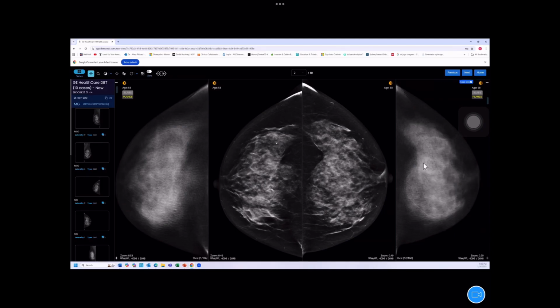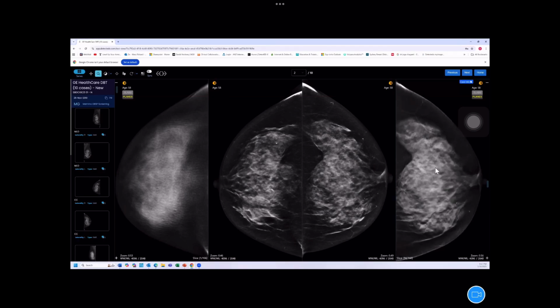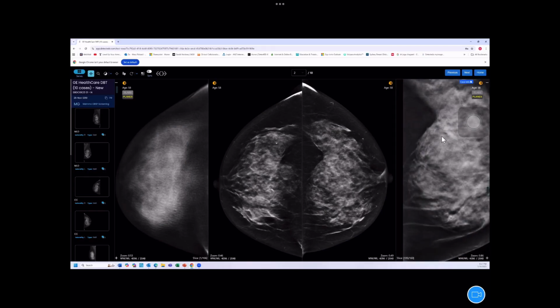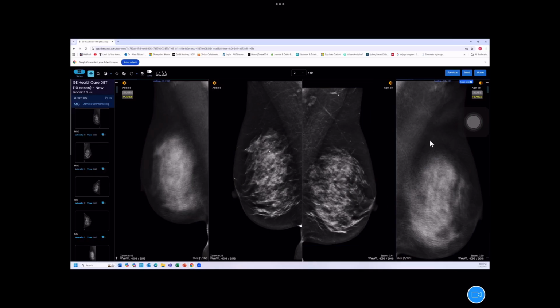So as we move through this, here we do have greater detail, but when we actually come to the lesion itself, it's probably not seen with any greater ease, even though we've done individual slices as opposed to slabs. Okay. So this again is a small invasive carcinoma. I'll show you, I think we haven't looked at this image, so we'll look at this one here. Might go back to the slabs.